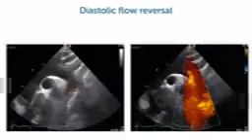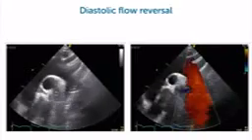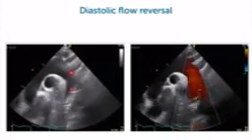And if you look at the image that you get on your screen, you will get this. Yes, and actually this is a really nice example of suprasternal view. We see part of the ascending aorta going into the arch with the branches departing, and the descending aorta.